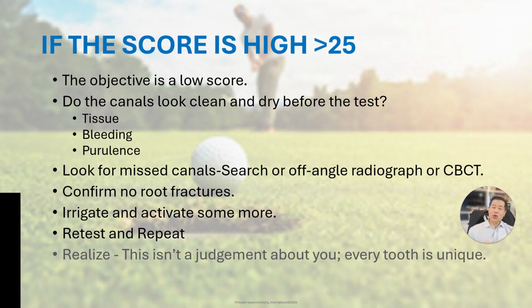When you get that score of 1, you feel really good because you've done about as good a job as anybody could. And when you obturate, as long as we do a good job when we obturate, we're going to have great success. So keep using the indicator, keep striving for those low scores, and just have fun with it. It shouldn't be a burden. It shouldn't be something you worry about. It should be something that you actually enjoy.